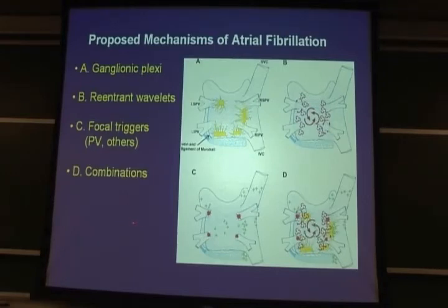And there are many, many animal models and many assumptions and many proposed mechanisms. But there's really no good assessment of this in humans, in the human disease, because there was no tool available like ECGI to do that. So we set out to do it. I think by now we have something like 40 patients, and we're preparing to write the paper.